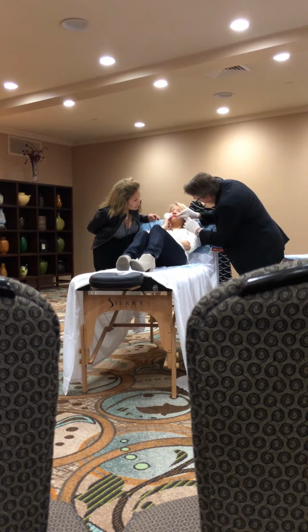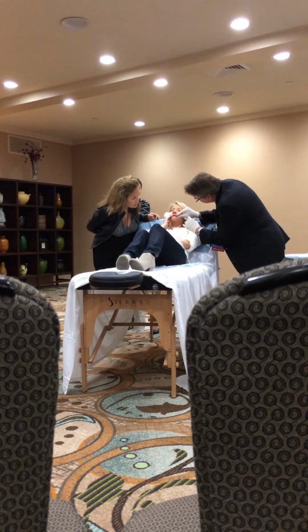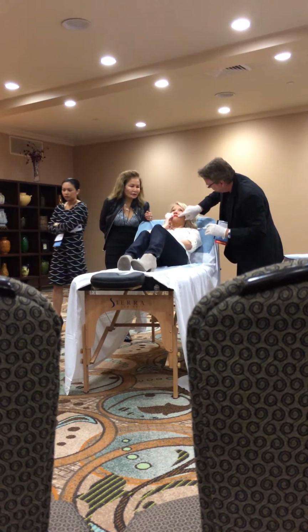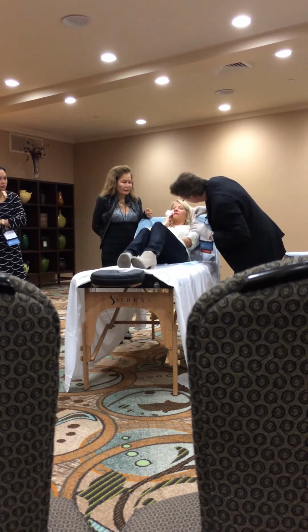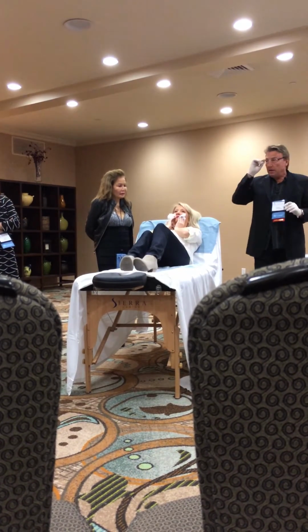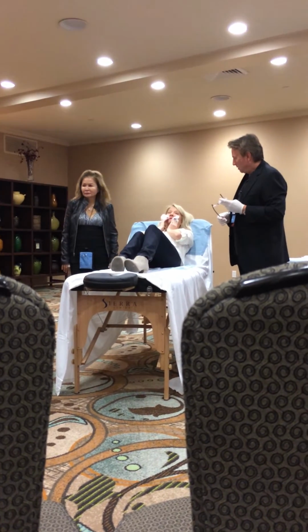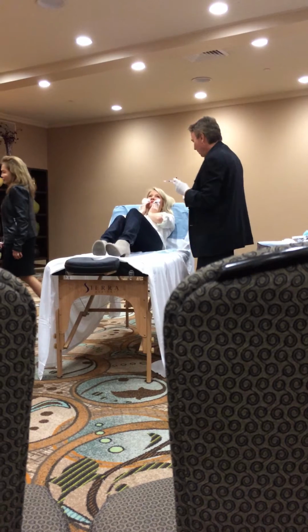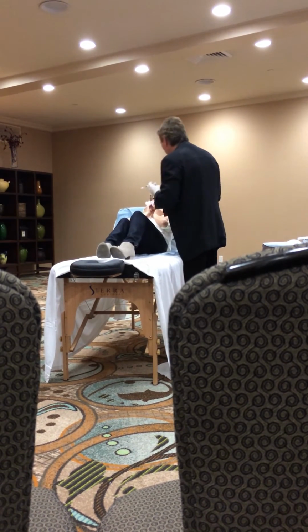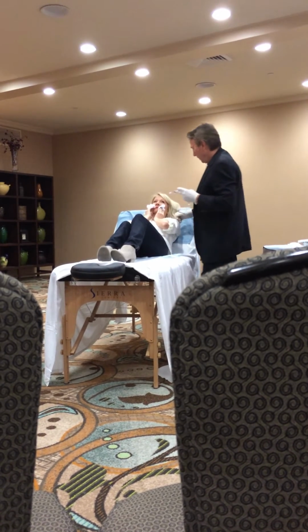I'm pretty superficial in the lip there. Okay? See that? It just kind of pops it out a little bit. There you go. Just hold that. Any other questions? Okay? I'm going to do a little bit more now. No, she'll hold that. And her cheeks are real nice and full. She's got a lot of nice soft tissue in her cheeks.